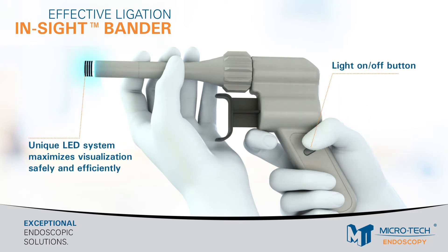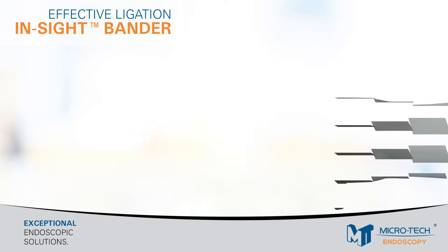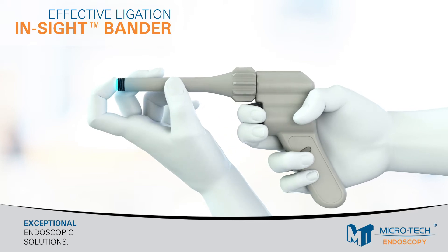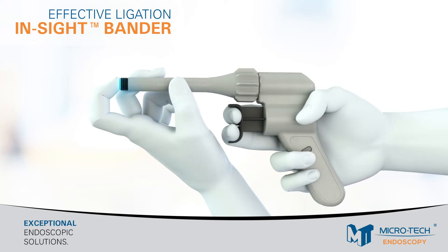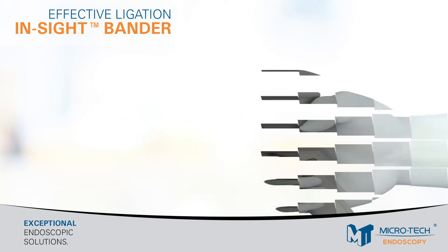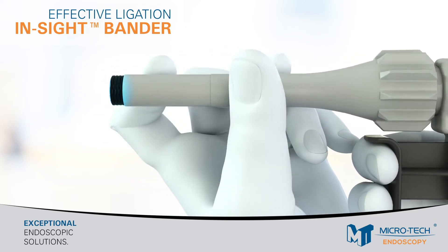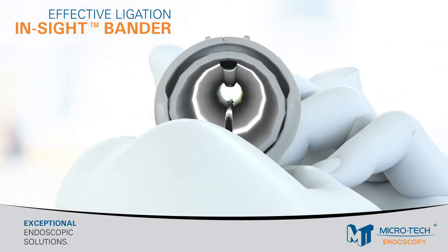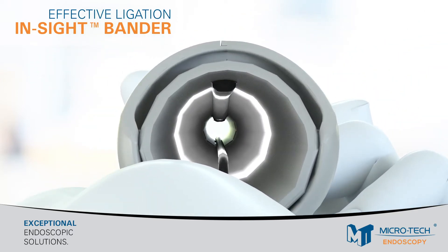To begin the procedure, turn the light on and check the suction by pulling and releasing the trigger. Move the bands to the front of the suction chamber by rotating the actuation knob in a clockwise motion. Direct visualization is possible by looking through the barrel of the device.